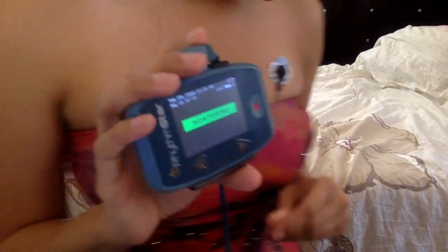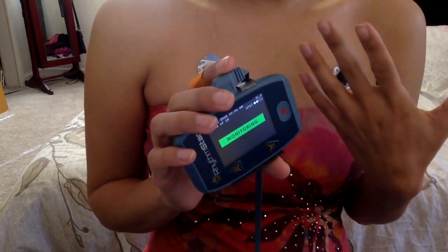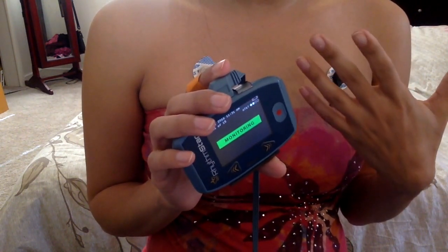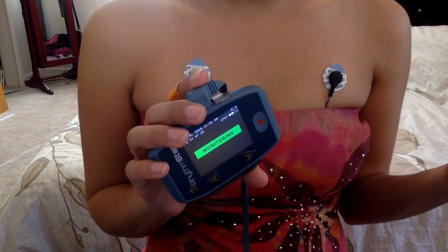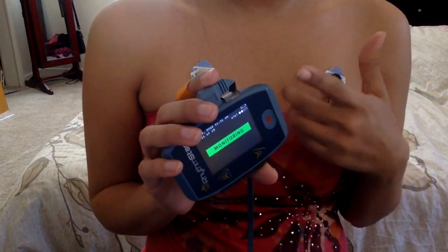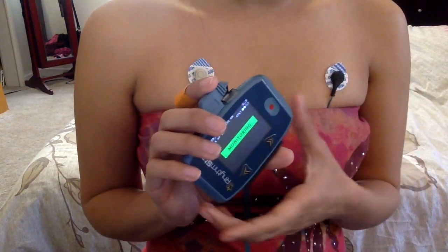I had something interesting happen the other day. I got a phone call from the heart monitor people, asking me, are you okay? Because your heart is racing. And this was at 7 in the morning. I'm like, oh, I'm sitting at my desk at work. I don't know what's wrong. They're like, well, we're picking up something. So if you could press in your monitor that you're okay, sit down for 5 minutes and rest, we can reset it. So that was a little scary.